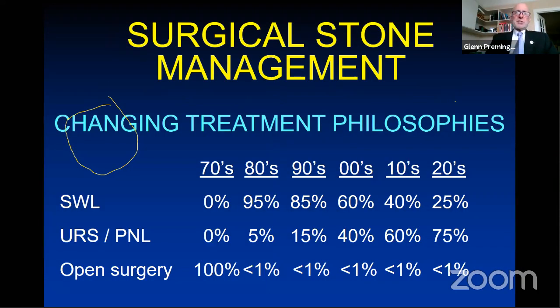And there's no doubt that in stones that don't pass, our philosophy for treating ureteral stones has changed dramatically. Back in the 80s, shockwave lithotripsy was the main way that we took care of patients with stones. But I would offer now in the 2020s, we see upwards of 70 to 85% of patients being treated with ureteroscopy for management of their symptomatic stones that did not pass.